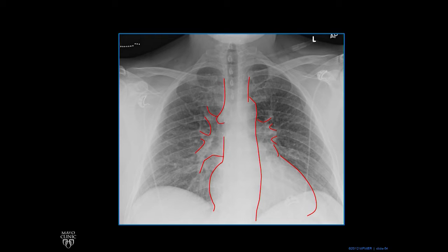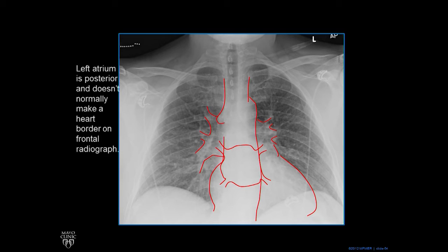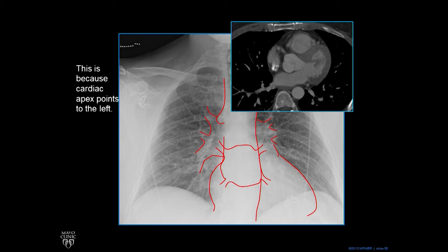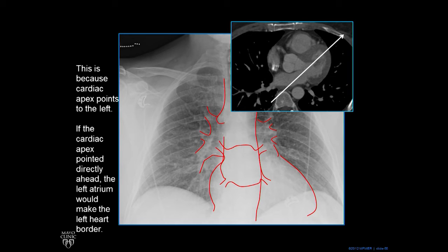We talked about the SVC, the azygous vein, the pulmonary arteries — next, the pulmonary veins. Now there's the left atrium. It's posterior and it normally doesn't make a heart border on a frontal radiograph. The reason is that there are all these other structures in front of it which have borders with the lungs, so you don't see it unless it gets large. The left atrium is right anterior to the spine because the cardiac apex in most people points to the left, putting the left atrium posteriorly.